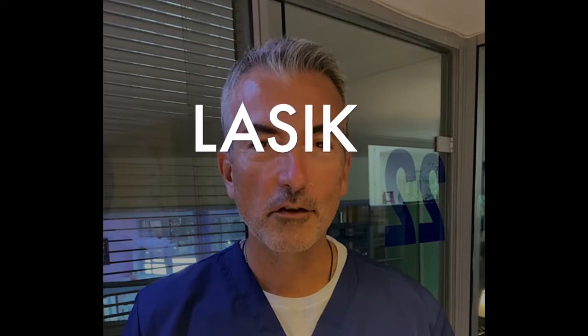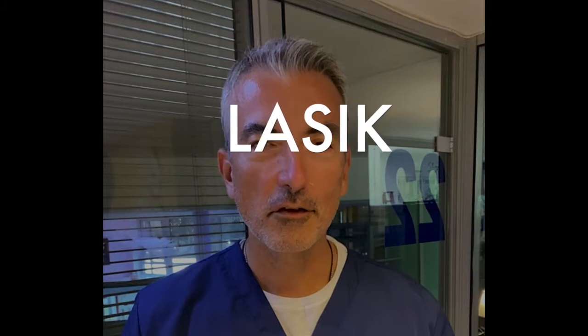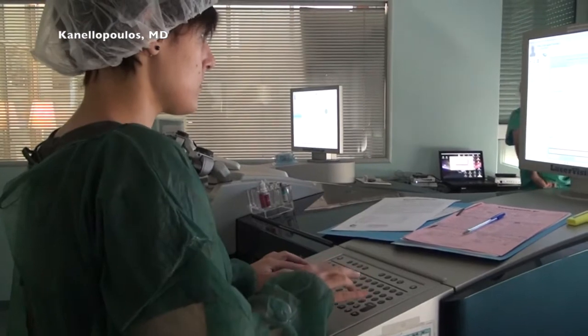Hi, this is John Kanellopoulos from Athens, Greece, and clinical professor of ophthalmology at NYU Medical School in New York City, New York. My pleasure to describe to you some of the basic principles of our LASIK technique.